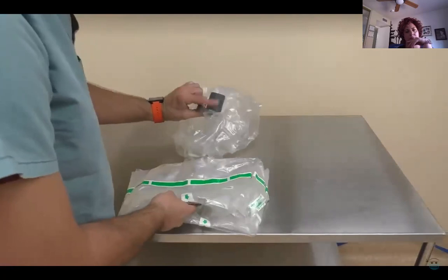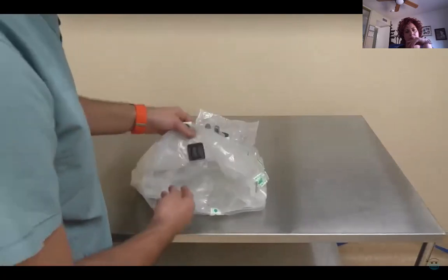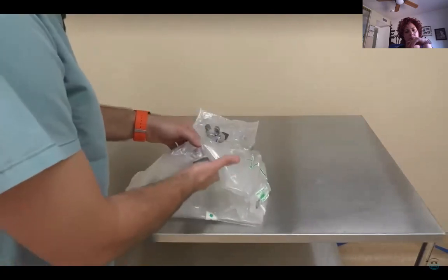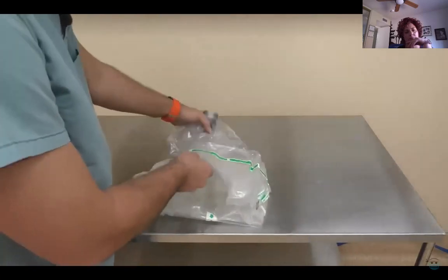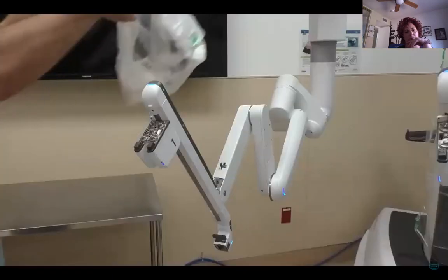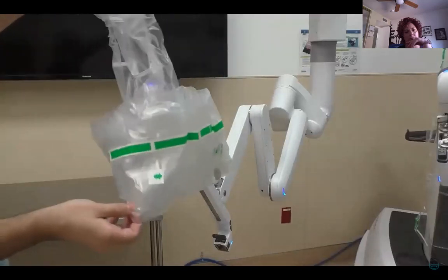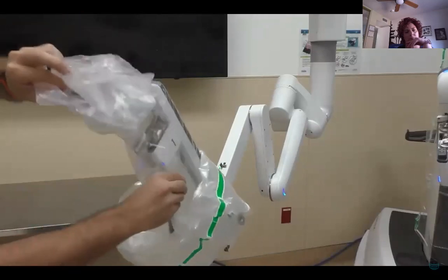You want to make sure this piece and this piece are facing forward when you drape this. So I like to put, obviously this is my hand, but sterile hand, and I like to grab both of these plastic pieces together and go directly over the arm like this. Starting it on the outside and kind of dropping it and draping it over the arm itself.